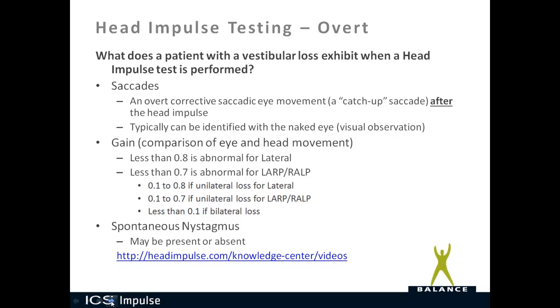A gain of 0.1 to 0.8 for lateral and 0.1 to 0.7 for LARP and RALP is typical of a unilateral loss. With a bilateral loss, the gain will typically be less than 0.1 for both the right and left sides. Spontaneous nystagmus may be present or absent.